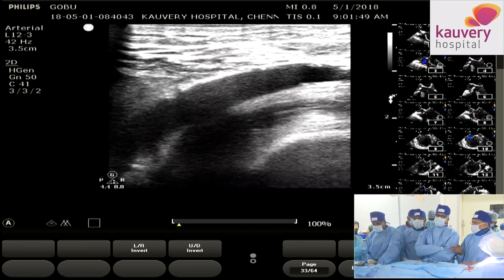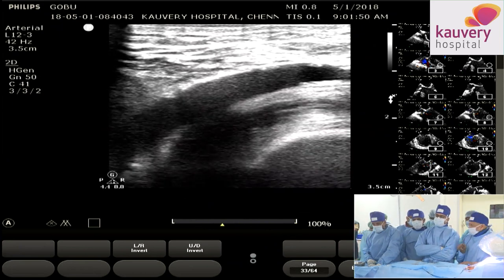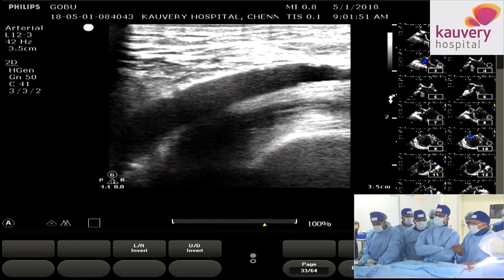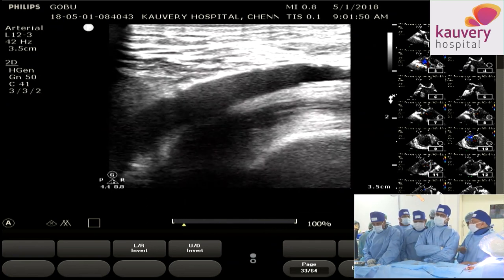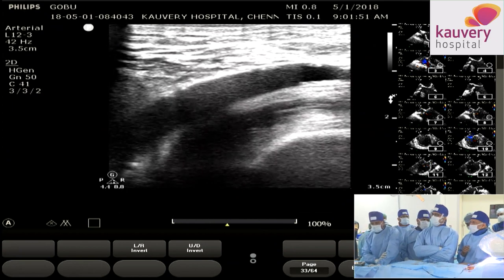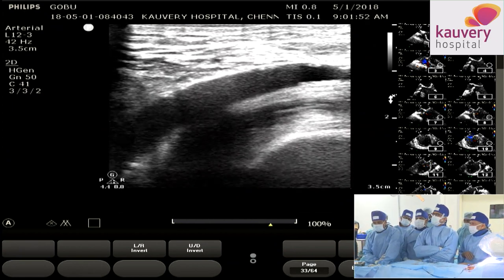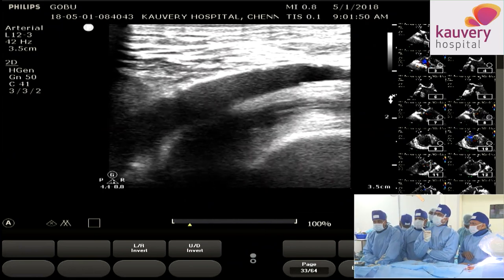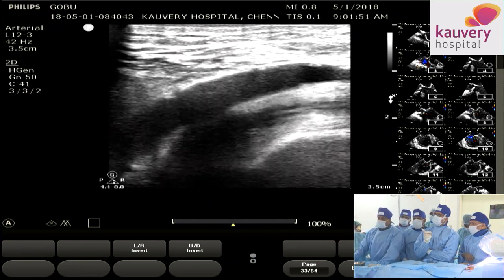Otherwise, one could take this pathway that you do a CT with less than 40 ml contrast or less than 20 ml contrast. Just look at the aortic root. That's all. Don't even look at the peripheries, so that you don't use too much contrast. All right, go ahead. Okay. So we're moving back to the peripheral examination. MPR on echo, we're going to show that in a second. On echo itself you can do that, but dilute contrast.